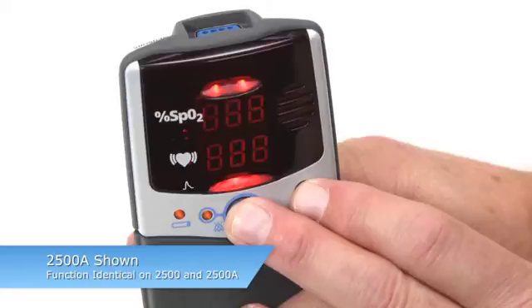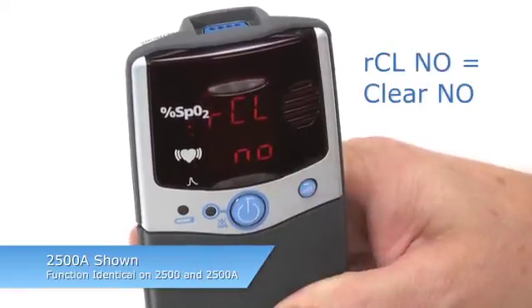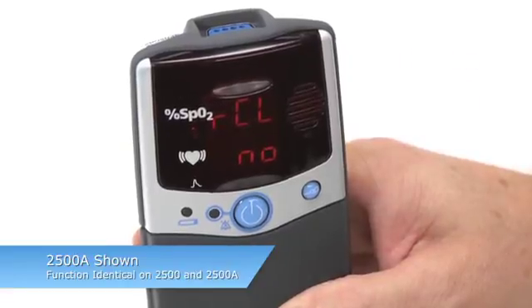A series of 3 8's will appear in the pulse rate and SpO2 areas, and the clock time will briefly appear, followed by RCL NO. This allows you to retain the memory on the oximeter or clear it.